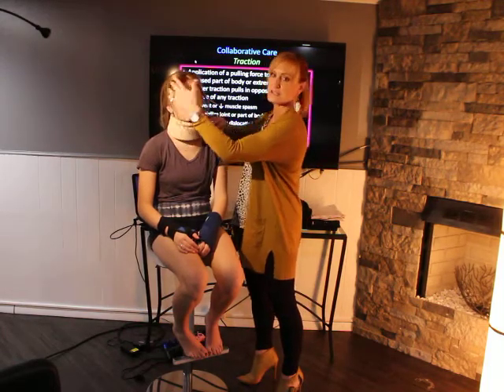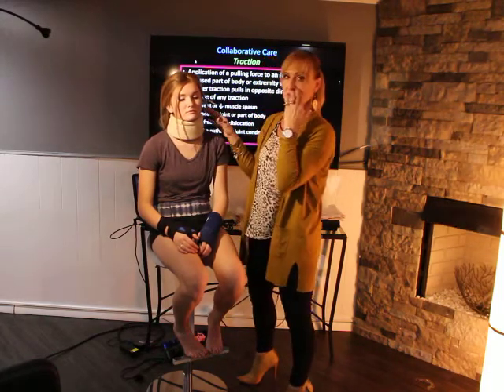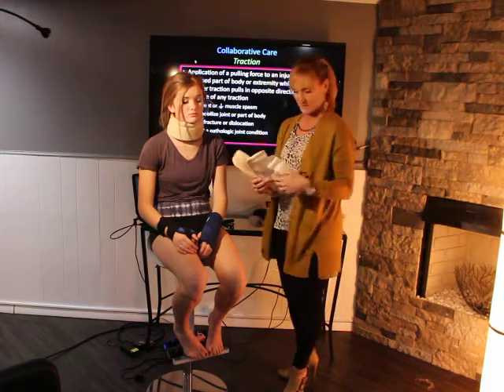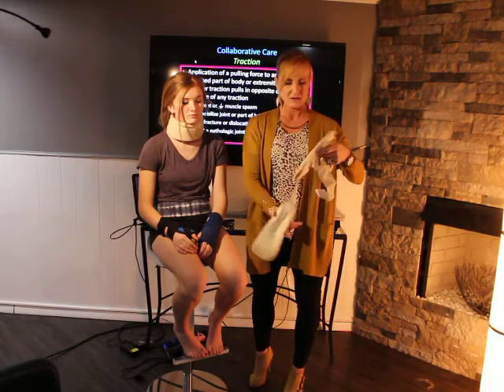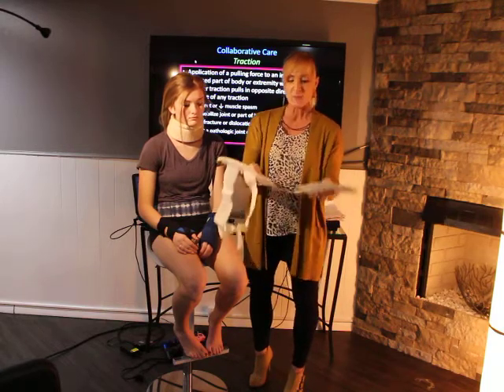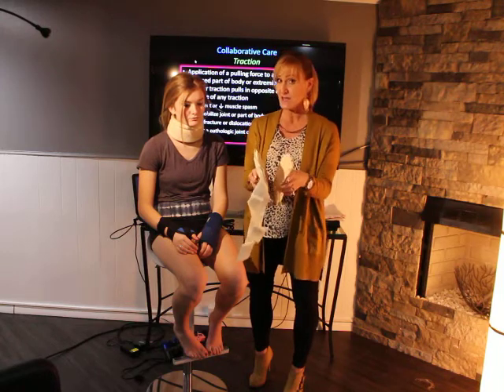So that's what patients like this would not be okay if those vertebrae are fractured. Then that patient would be in something different, like a halo. The other thing that I talked about in the other lecture is something called a splint or a sugar tong, and these kinds of braces are especially good if your patient does have a broken bone.